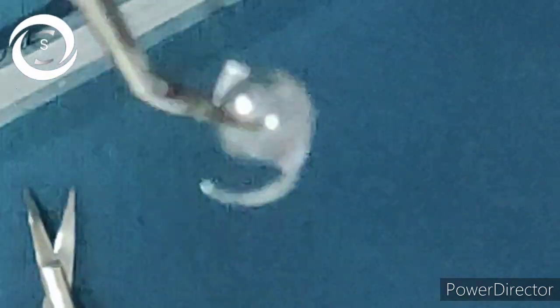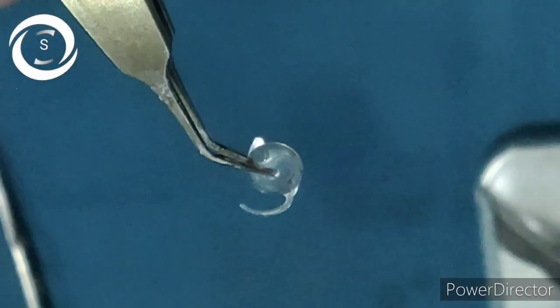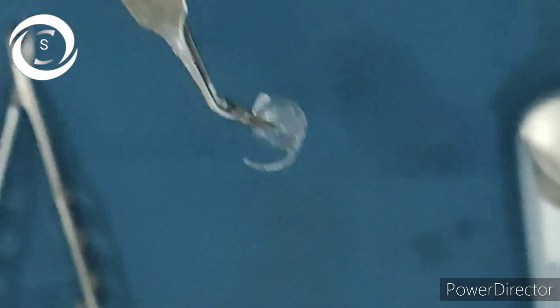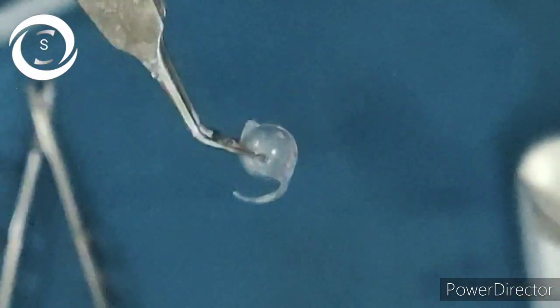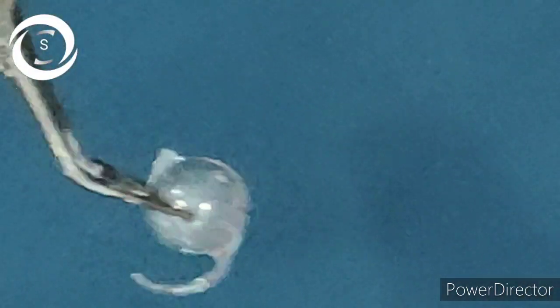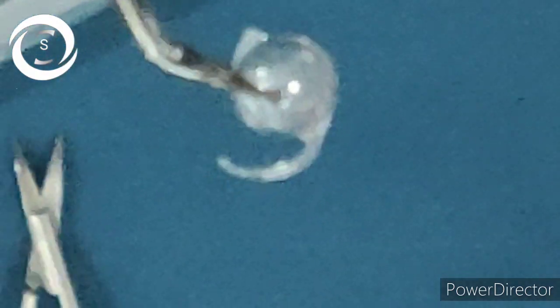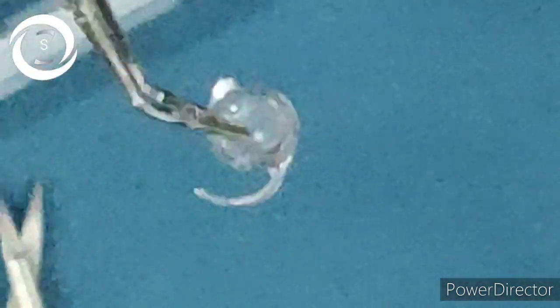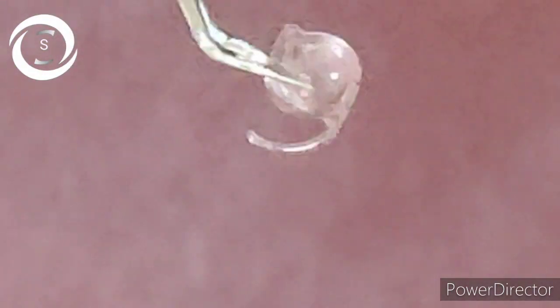Surgeons always learn from past mistakes. I would like to narrate a story from almost three years ago. The same thing happened — one haptic broke at the optic-haptic junction. I put the IOL in the bag because I had performed a smaller round capsulorrhexis and constricted the pupil. The IOL was well centered in the supine position and my assistant said 'job well done.'